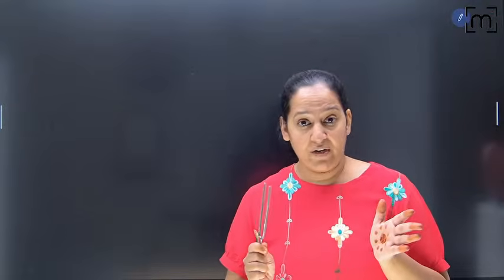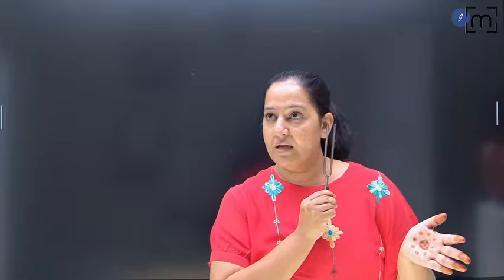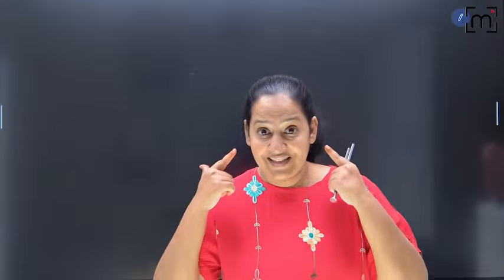Firstly, I am activating it and keeping it at 2 centimeters. I can hear the vibrations very well. Let's do it in this ear. I can hear the vibrations here very well too. Thankfully both my ears are good, I am not having deafness. And what is it testing?